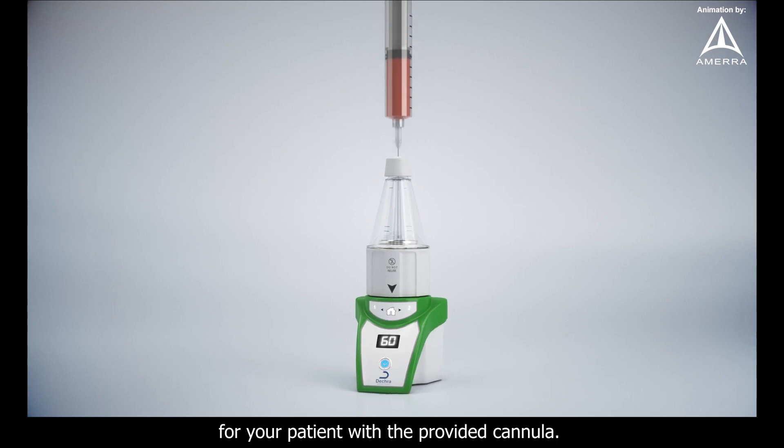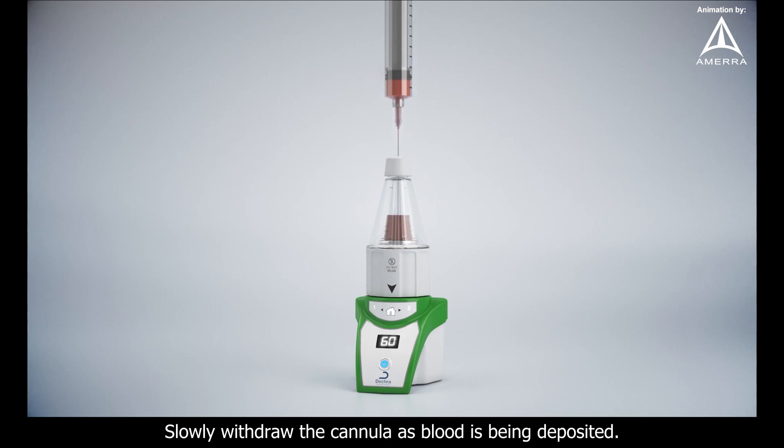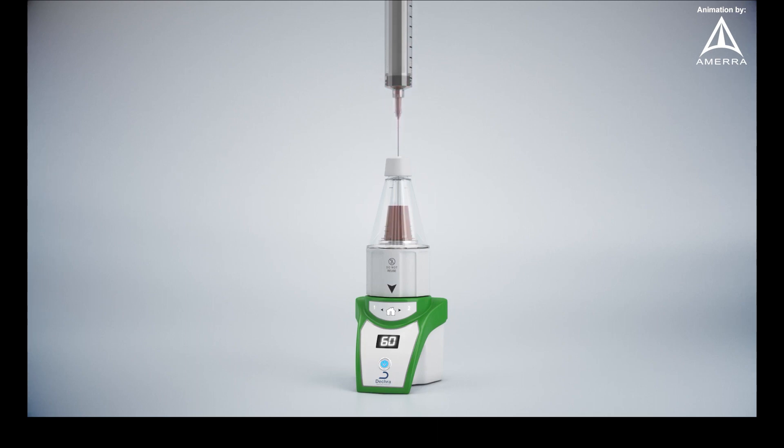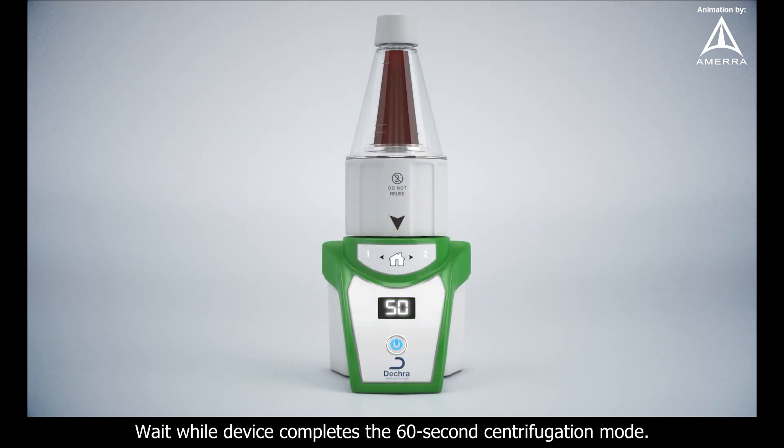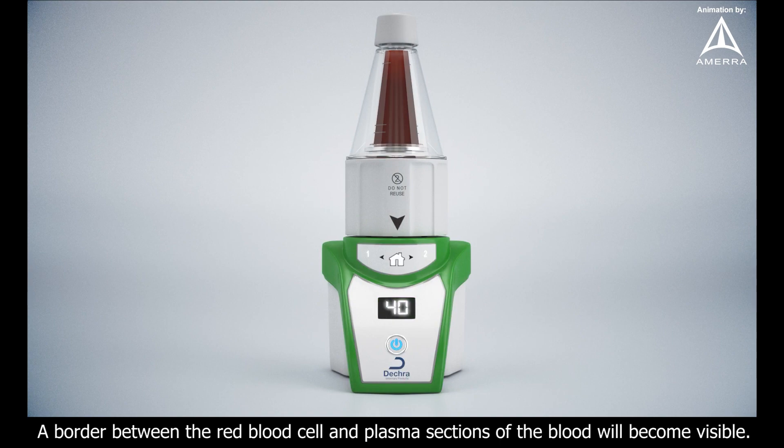Transfer entire contents of syringe into appropriate size kit for your patient with the provided cannula. Slowly withdraw the cannula as blood is being deposited. Press the activation button. Wait while the device completes the 60-second centrifugation mode. A border between the red blood cell and plasma sections of the blood will become visible.